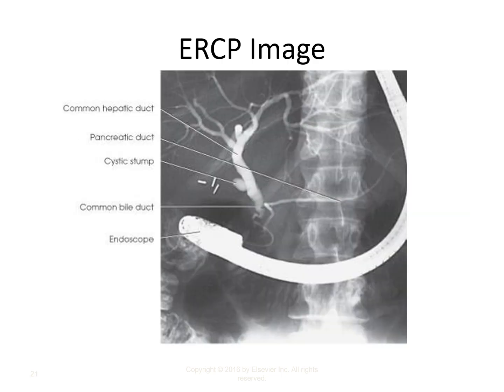Right, so here's our ERCP image. You can see our endoscope here at the bottom of the image. It's coming in from the esophagus, going through the stomach, and then into the small bowel here at about the right half of the screen. And then there's a catheter coming out of the end of the endoscope, and the catheter has entered the ampulla and is injecting contrast that's filling the common bile duct.